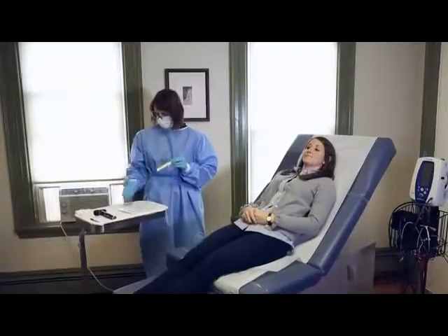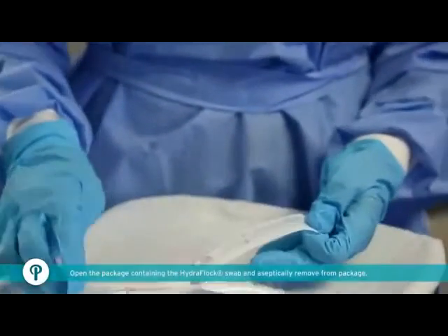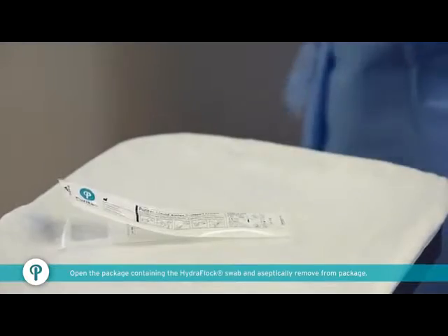Have the patient facing a strong light to ensure the area to be swabbed is visible. Open the package containing the Hydroflox swab and aseptically remove from package.